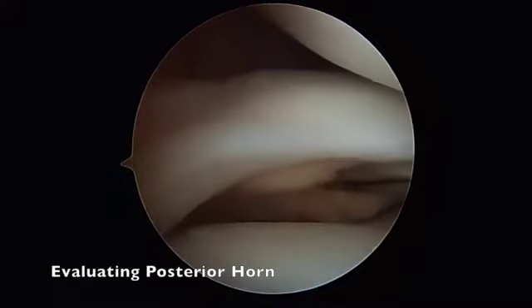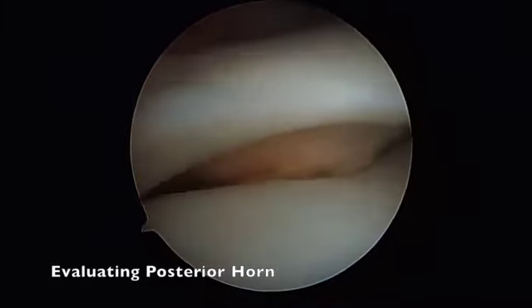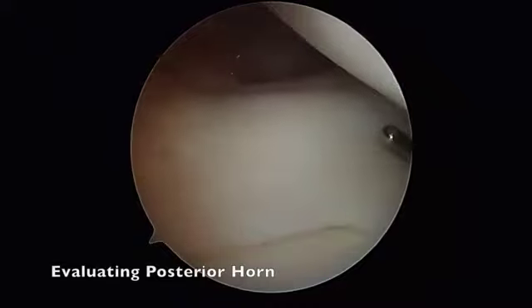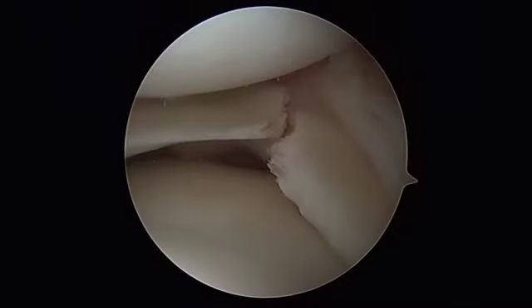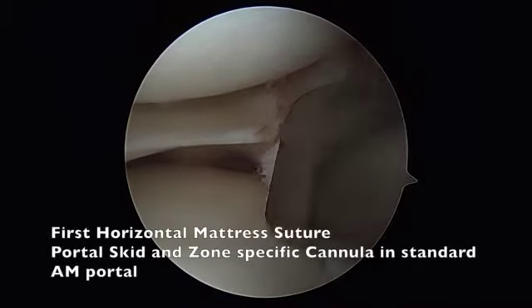Now, with the arthroscope in the accessory anteromedial portal, the portal skid is placed into the anteromedial portal to protect the cartilage.